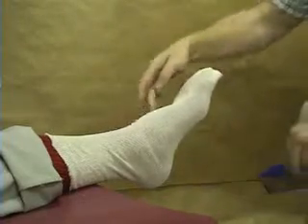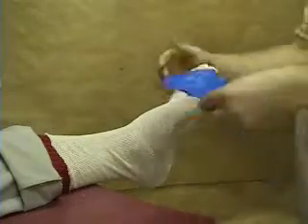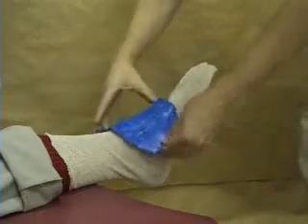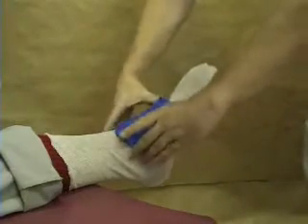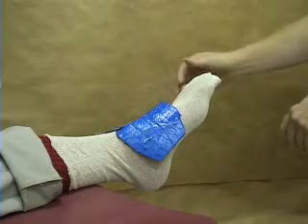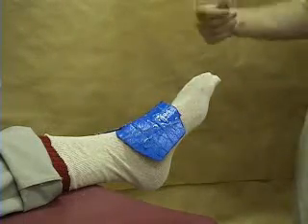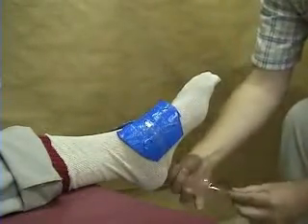Later on we're going to have to be making some cuts through the casting material in order to remove the foot, so I'm going to place a cutting guard on top of the foot, and that will just protect the foot while we cut the casting material off. That's been coated in Vaseline, and that will allow it to be removed more easily from the casting material. So I'll just use some Scotch tape to hold that cutting guard in place.